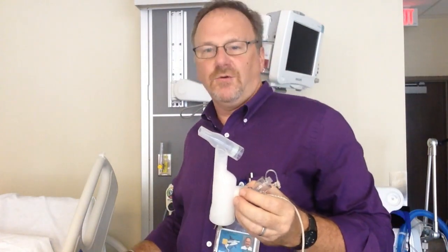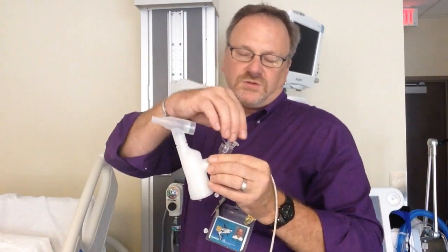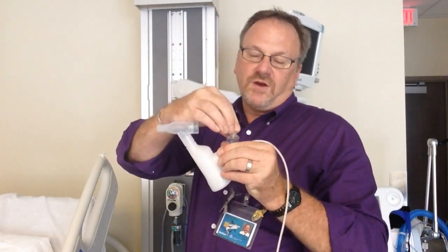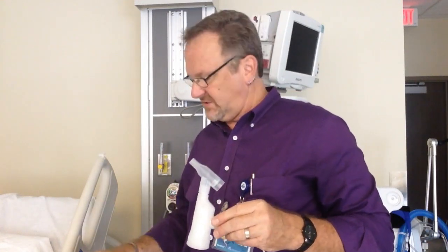That is the Aerogen Vibrating Mesh Nebulizer. You will also possibly be using this with other medications, such as Flolan for pulmonary hypertension — we'll get into that next semester.